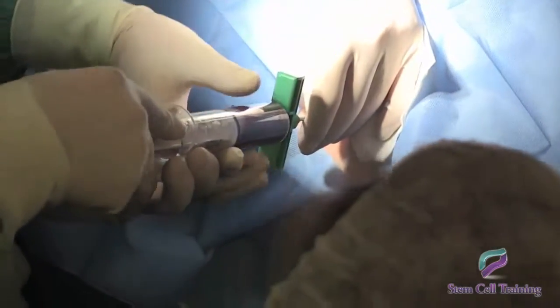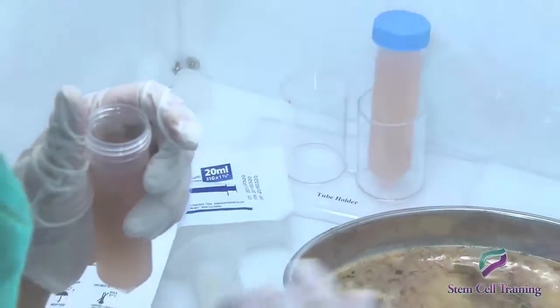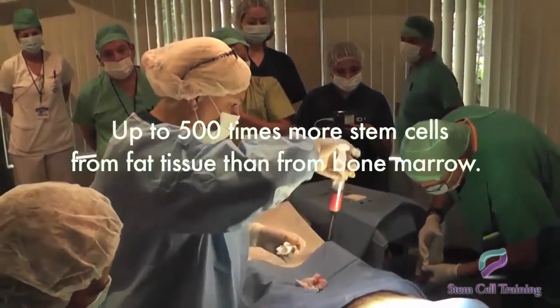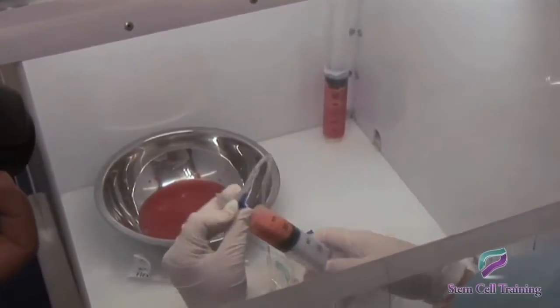As well as firsthand demonstrations on how to isolate adipose and bone marrow derived stem cells. It turns out that one place where we can isolate stem cells is from the fat tissue, or adipose tissue. In fact, we can get up to 500 times more stem cells from fat tissue than from bone marrow.